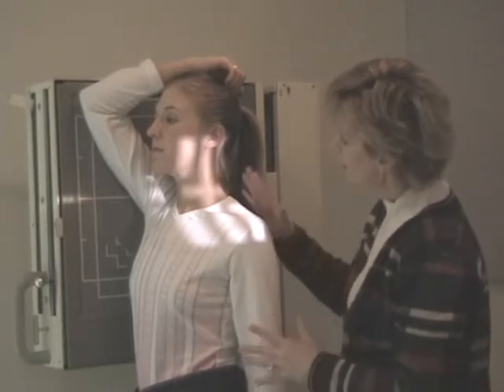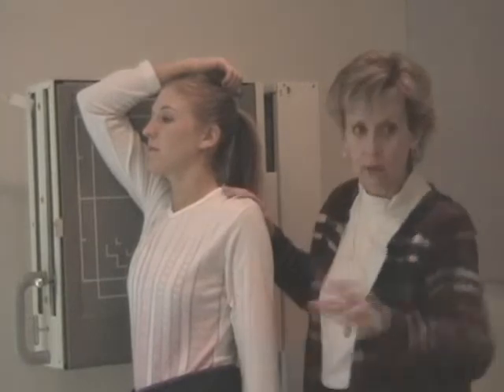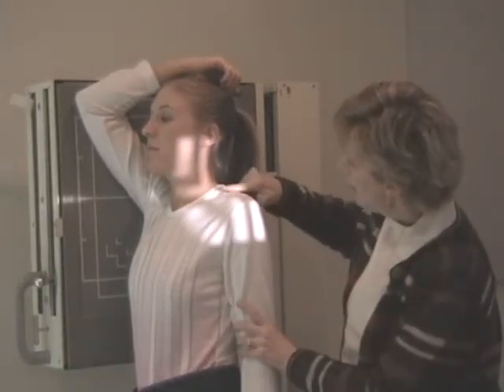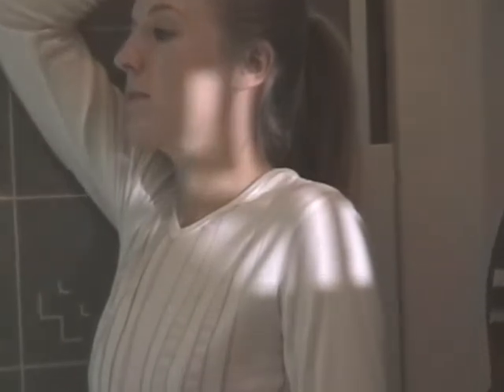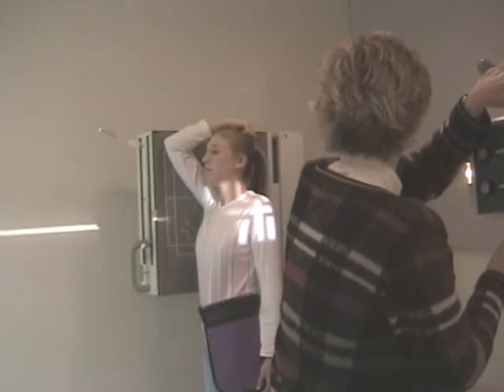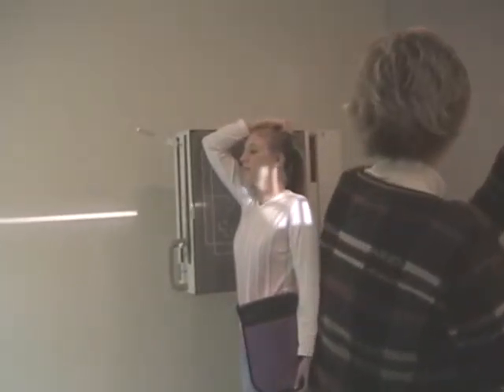What if Kristen did have those bigger shoulders? This shoulder may not come down so much. Okay? We're kind of mocking the scenario now. See how the crosshair is not clearing that shoulder? There it's clearing it. There it's in the way. You might have to put a 5-degree caudal tube angle on this if you didn't clear the shoulder. Put a 5-degree caudal tube angle on there. I think the camera can see. And you'd have to fix the adjustment to come down through C7.